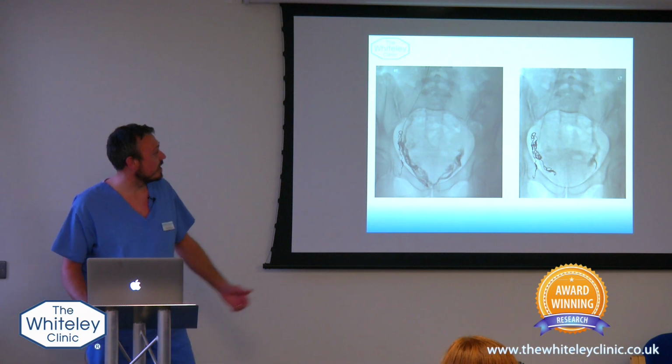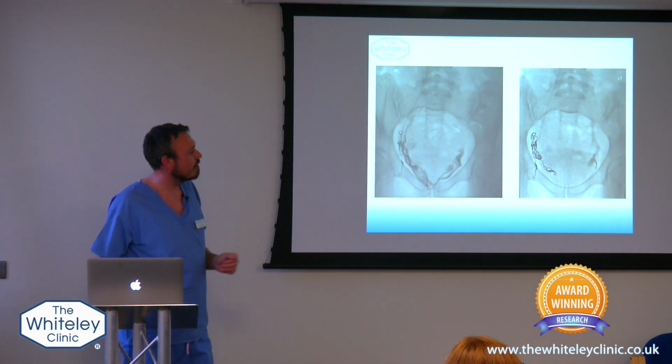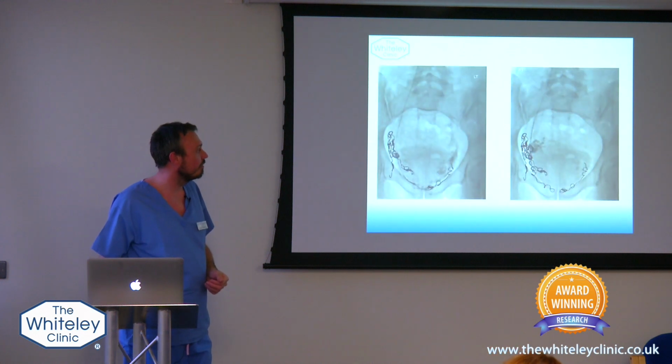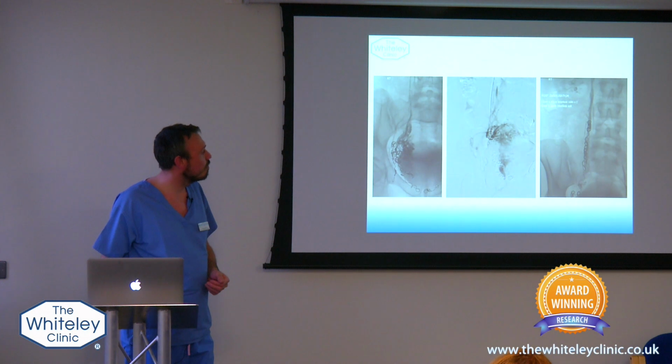So this is the network of veins that are coming down. These are your pudendal veins. The picture on the right just then shows the coil and the pudendal vein. And these are just more pictures, of course.